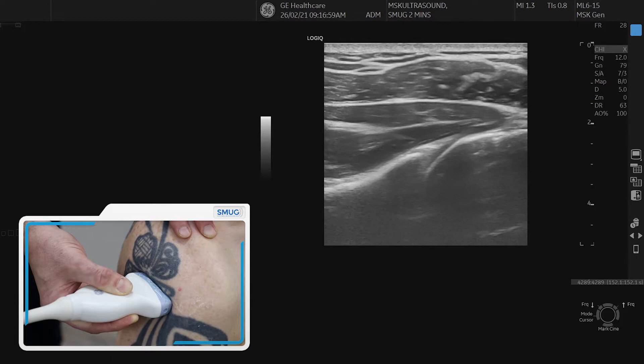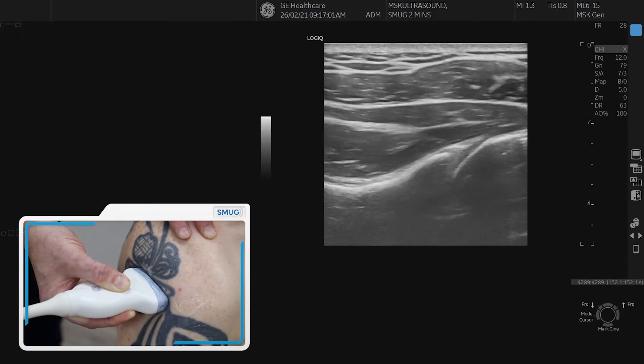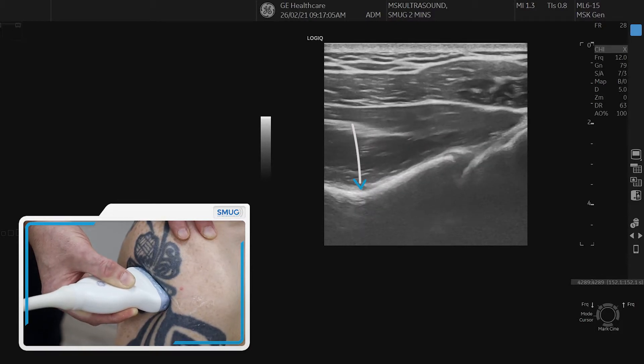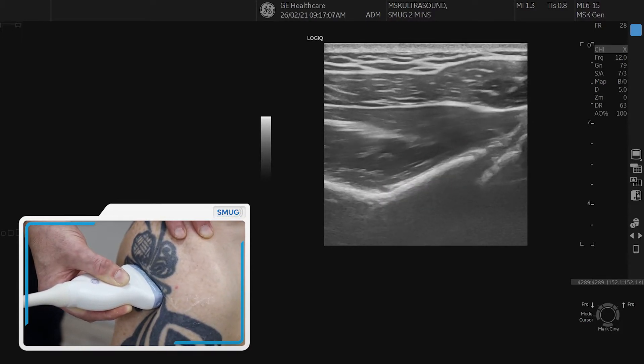If you follow the glenoid and go a little bit more medial, then there's your spinal glenoid notch. If you externally rotate it once more, you can see a little blood vessel coming in there, and back.